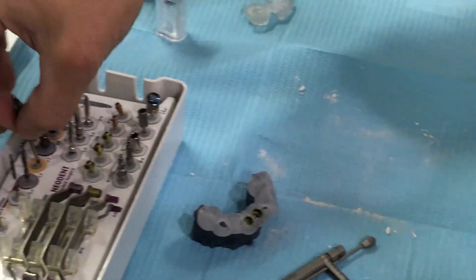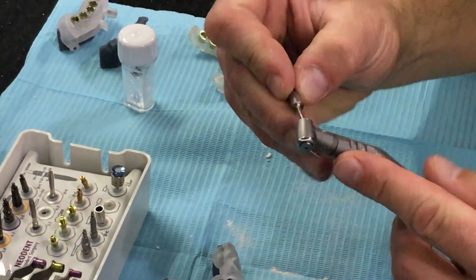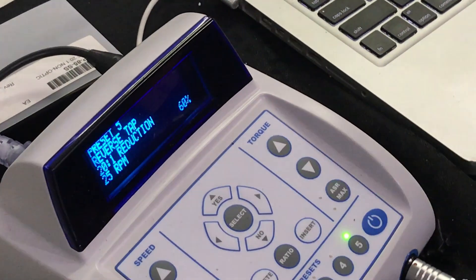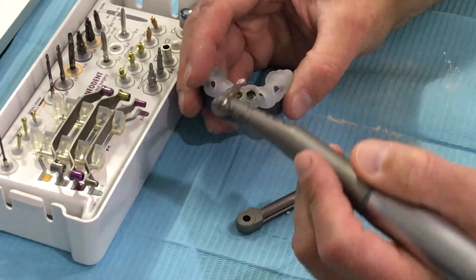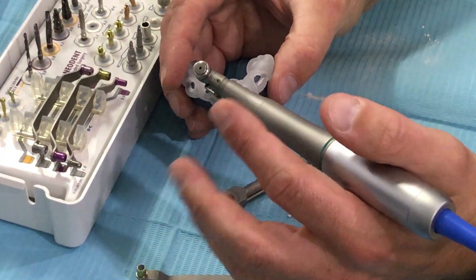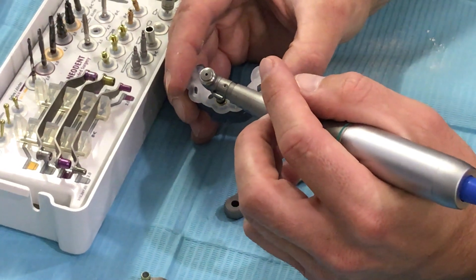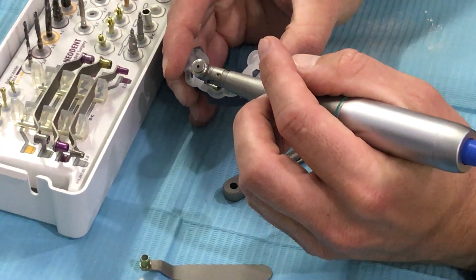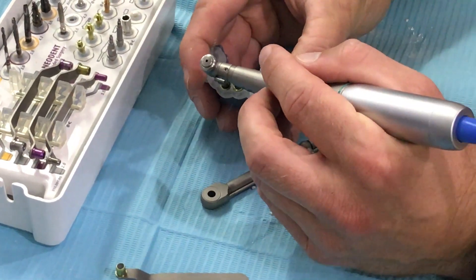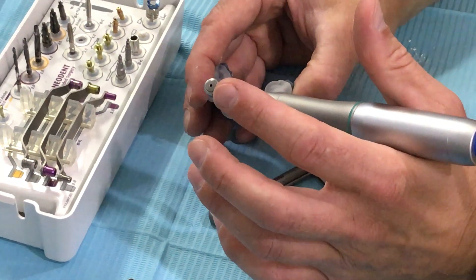Because of the quality of this bone, I'm now going to switch over and use my adapter and attach my bone tap. This is important — this is in the next row down, so it's imperative that I switch over to implant placement speed, about 25 or 30 RPMs. I'm stepping on the pedal — it happens to be in reverse, I hear the beeping — so I put this in forward and I'm just gently resting this into the osteotomy. My hands are loose and I'm letting it just thread itself down. I then put this in reverse and let this tap back itself up. I'm not doing anything, not pulling up on it, and I should be ready to place the implant.